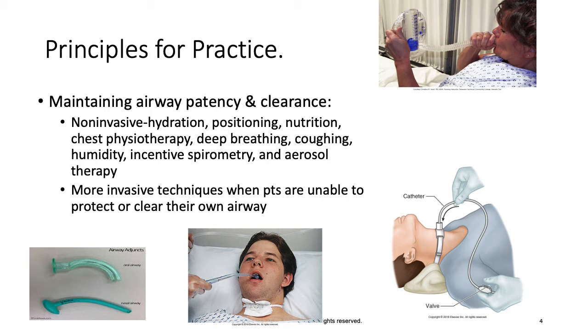The middle picture is of a patient with a yankauer to remove secretions from the mouth. And just remember, when you're using that, you want to just gently guide it around the gum line. Be careful. You don't want to injure the patient's teeth or knock teeth out, so you have to be really careful to keep it around the gum line, and also don't push it too far back into the mouth to elicit the gag reflex.